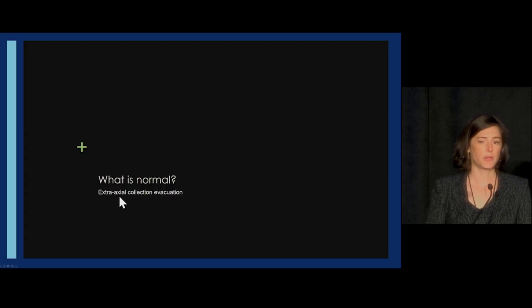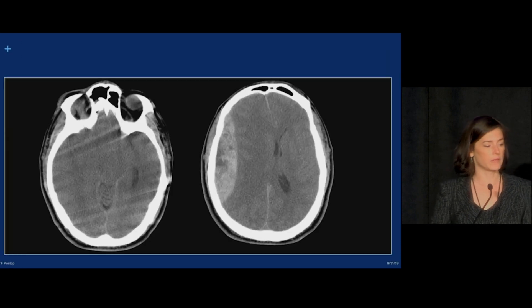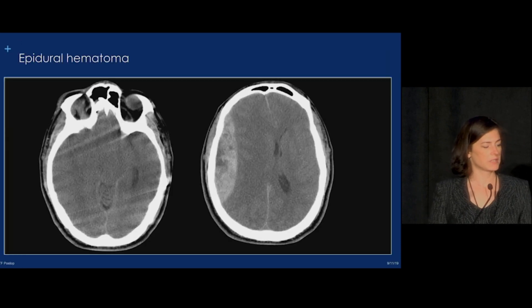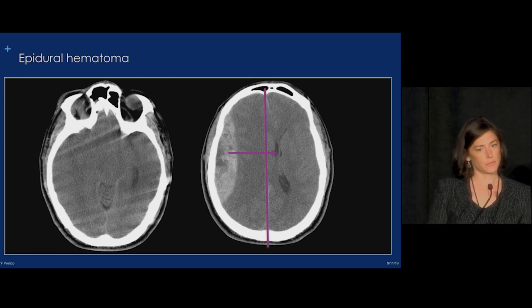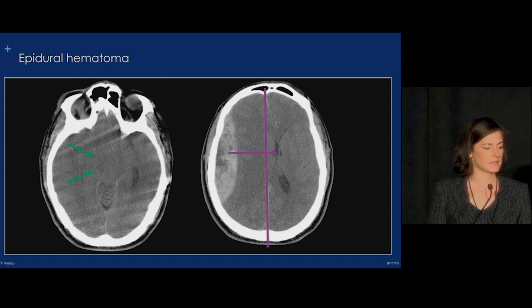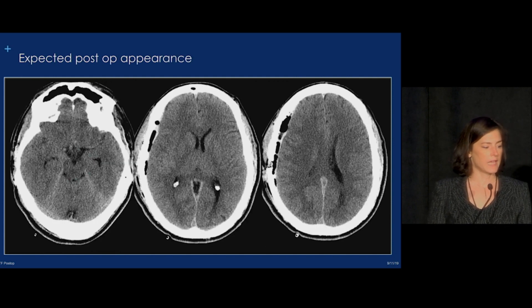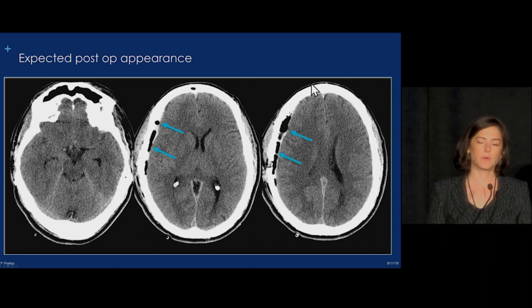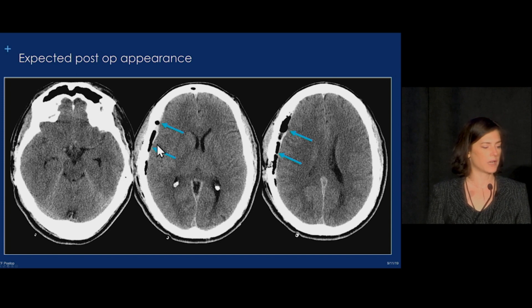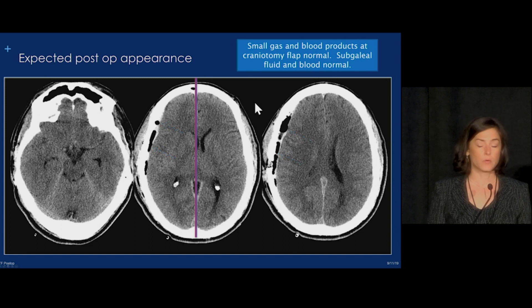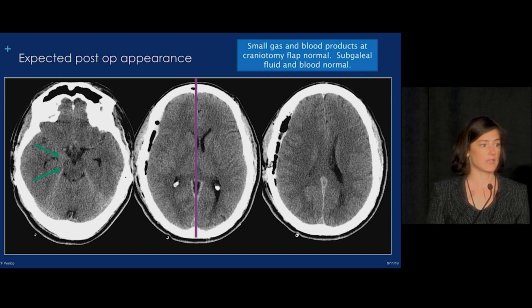When we talk about postoperative complications, the first thing we need to know is what is normal. Here's a patient that has an epidural hematoma, and we can see they're running into trouble. They have significant midline shift and some transtentorial herniation. After the hematoma is evacuated, we normally see a resection site with some hyperdense blood products or proteinaceous material and some gas. Importantly, the midline shift is significantly improved and the herniation has essentially resolved. This is all expected change.